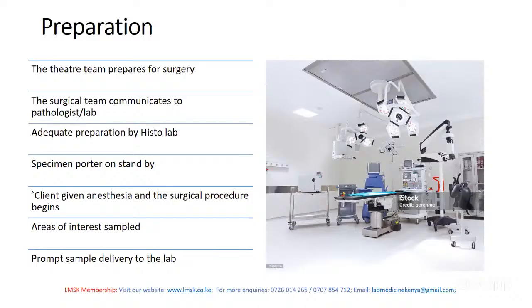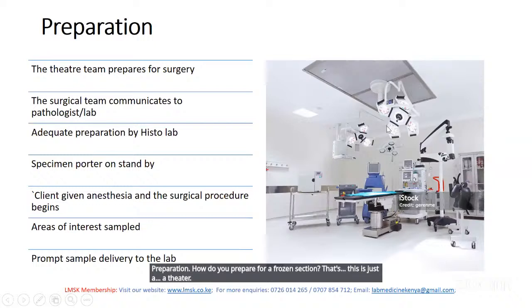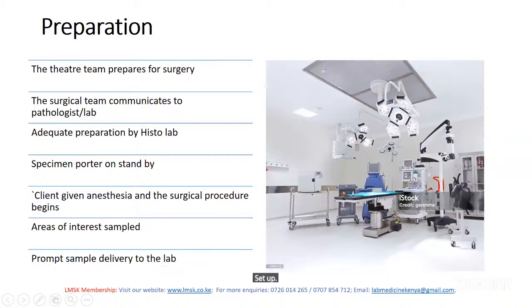Preparation. How do you prepare for a frozen section? This is just a theater setup. So how do you prepare for a frozen section? The theater team prepares for surgery.